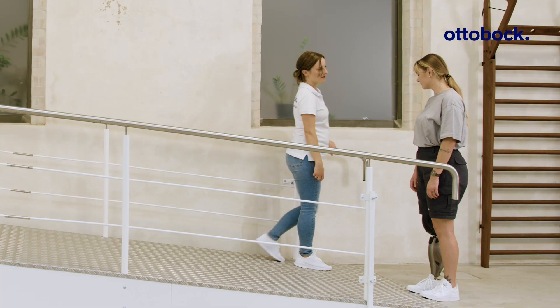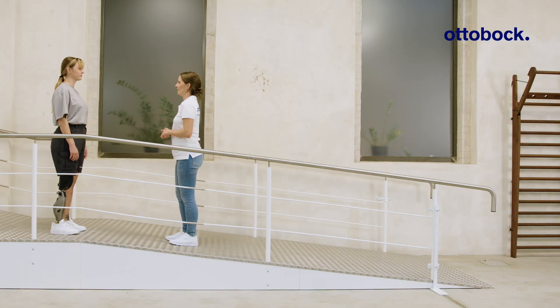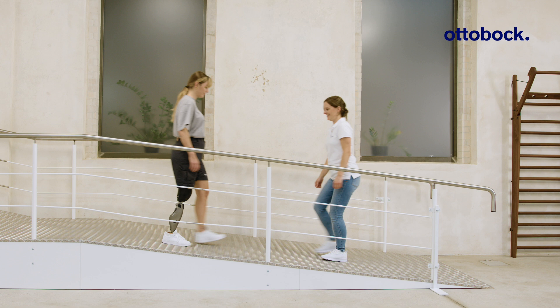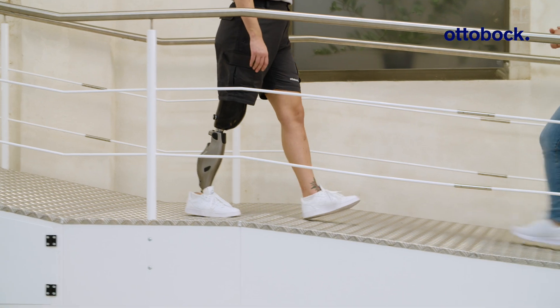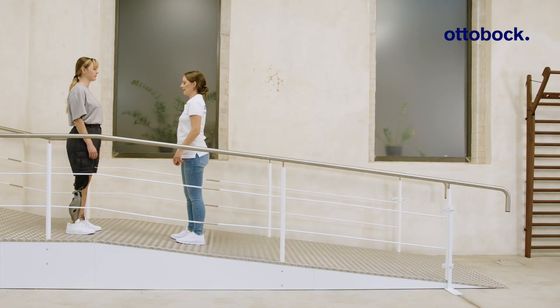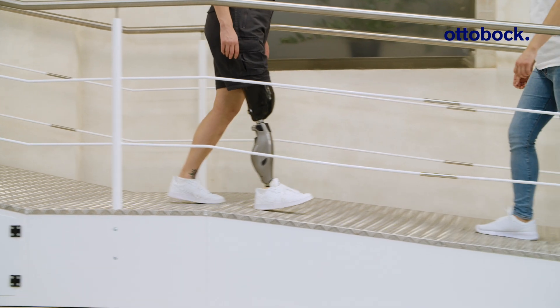When walking downhill on shallow slopes, users have two options. The first option is to walk with stance release. After achieving full foot contact, the center of mass moves forward and generates knee extension in terminal stance that triggers stance release. If knee extension cannot be achieved, it's possible to walk with yielding steps.